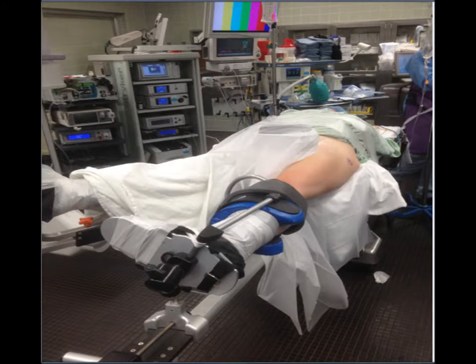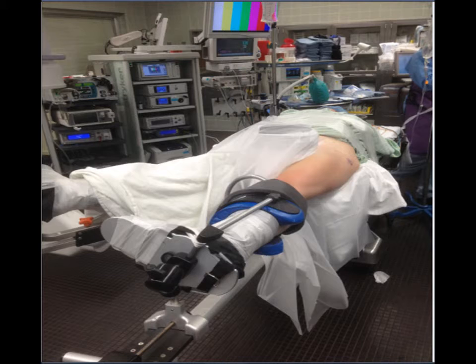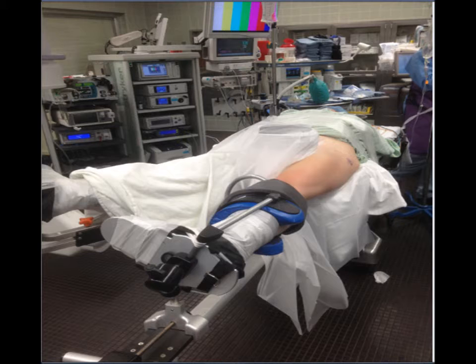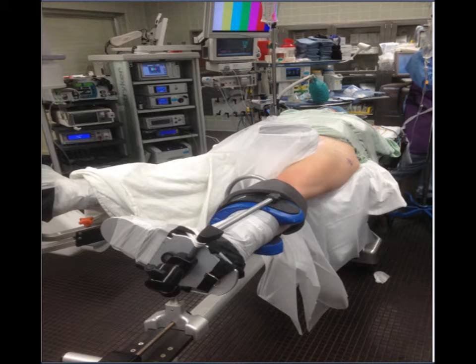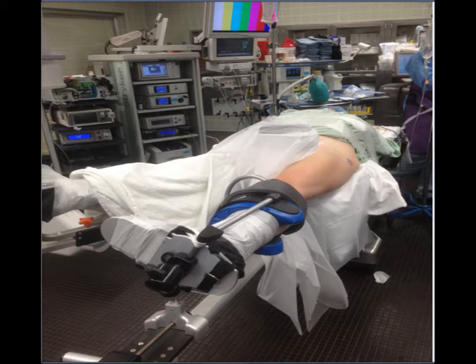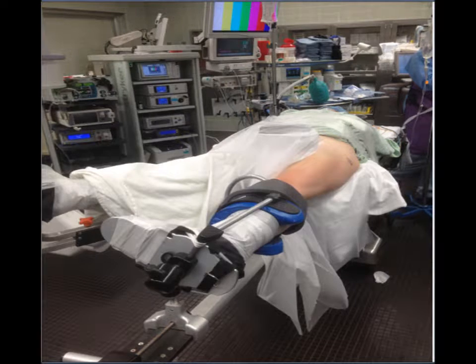At our institution, hip arthroscopy is performed with the patient in the supine position, utilizing traction, a well-padded perineal post, and fluoroscopy. The hip is subluxated with extension and adduction maneuvers.